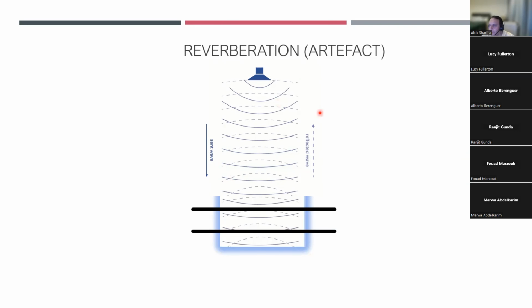Sure. Okay. Now, as I said to you, this is basically the probe. The probe is generating sound waves which are coming through. These sound waves hit the pleural surface. When they hit the pleural surface, what is happening is that the pleura basically starts shaking.